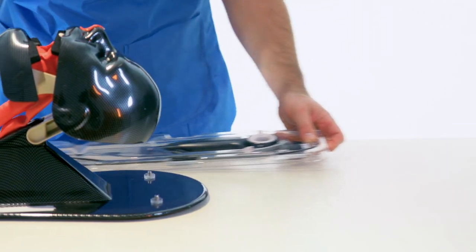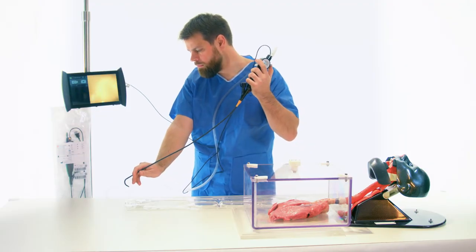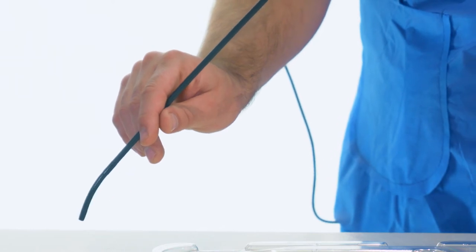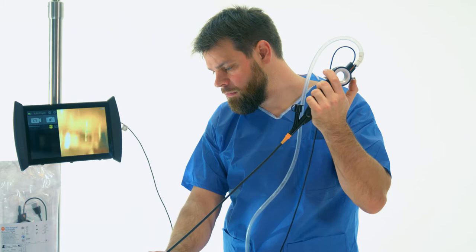There are no protective covers or accessories that need to be removed. Before using the product, control checks on bending, suction, and image display must be performed.